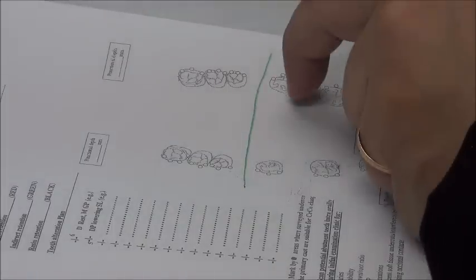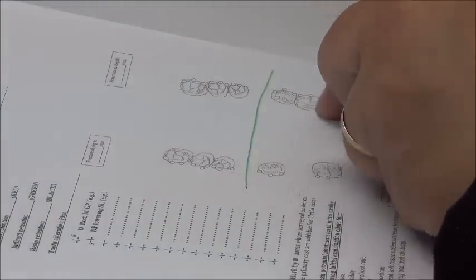But if I cannot extend to the 8, I'm okay with extending one tooth ahead only. So if I could not place the rest on the mesial of the 8, it would be too bulky inside the mouth. I could put it on 7. Either on the same tooth on the other side or at least one tooth before, but not more than that. Okay? So I have two options. I have the option of putting a rest on the 8 and doing the double Akers here, or the rest on the mesial of the 7, double rest, mesial and distal of the 6 as well, and double Akers. These are all options. Okay? The double Akers provides me with two clasps, so I could eliminate the clasp here.